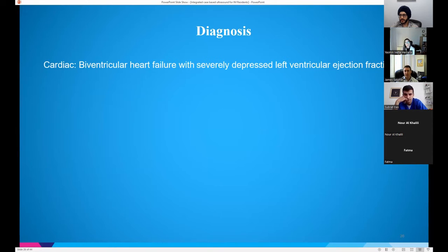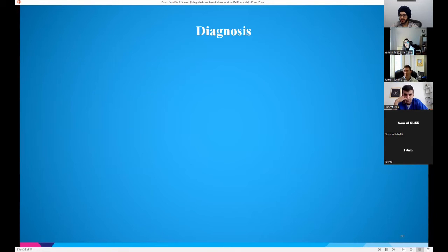So cardiac, what did we say? And I keep hitting it and I gave it away. Nero's smiling like she knows. So what did we see in the cardiac and the thoracic views?